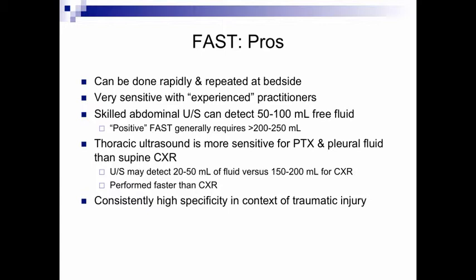So the pros of the FAST exam are that it's portable. The patient doesn't need to go to CT. It can be done at the bedside in an unstable patient. It can be repeated. And in the hands of very experienced practitioners, it's extremely sensitive.